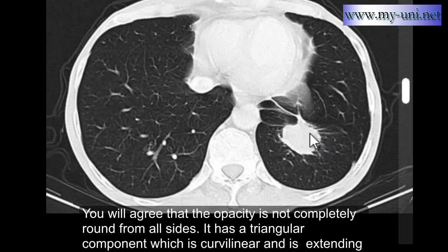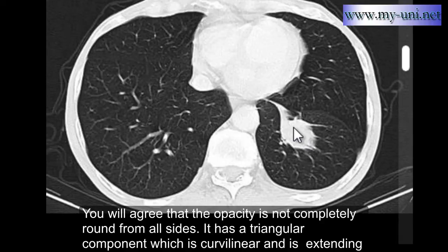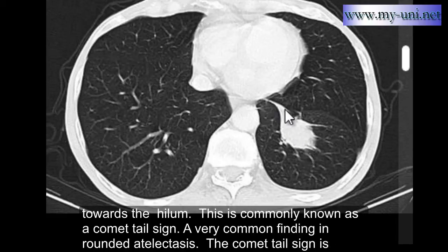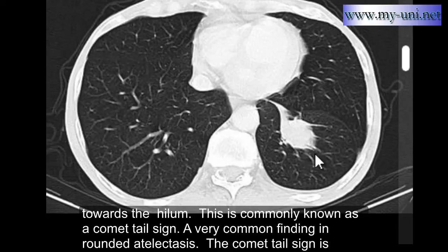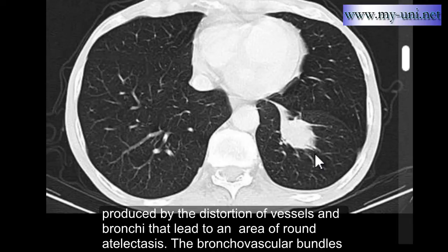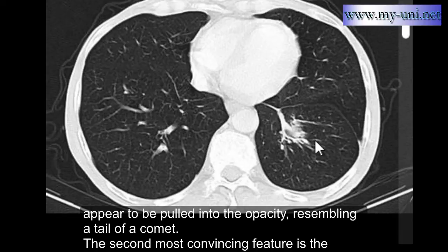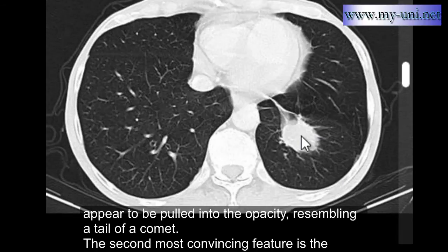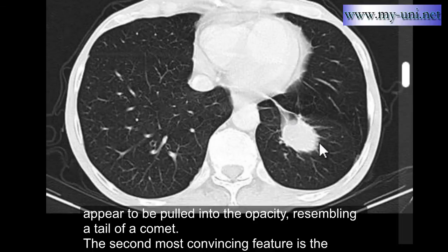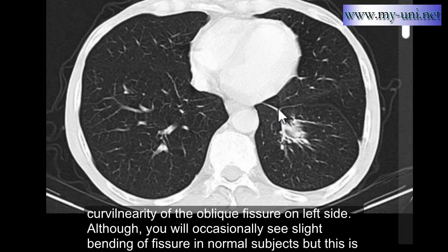It has a triangular, curvilinear component extending towards the hilum — this is commonly known as the comet tail sign, a very common finding in rounded atelactasis. The comet tail sign is produced by distortion of vessels and bronchi leading to the area of rounded atelactasis, with bronchovascular bundles appearing pulled into the opacity, resembling the tail of a comet.